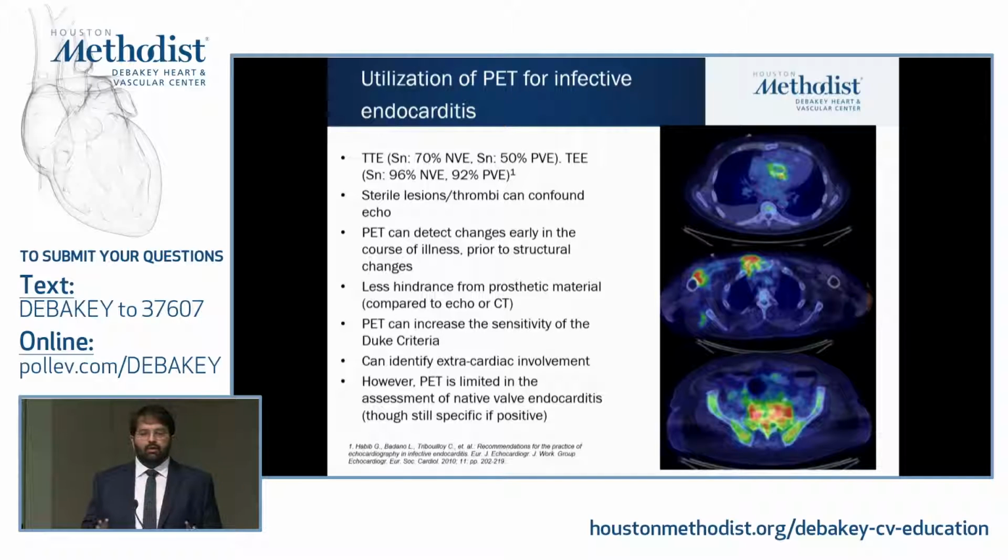So, the theme of this talk is that we can do most things here without PET. PET helps us do it better, and it adds a layer of certainty. It fits into the clinical and the imaging picture.